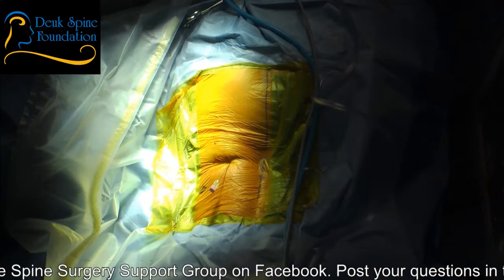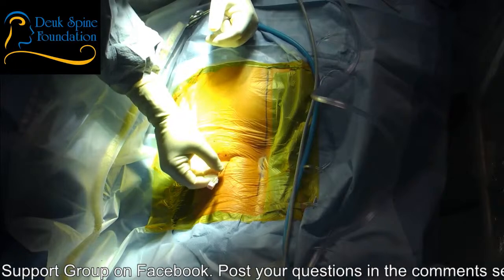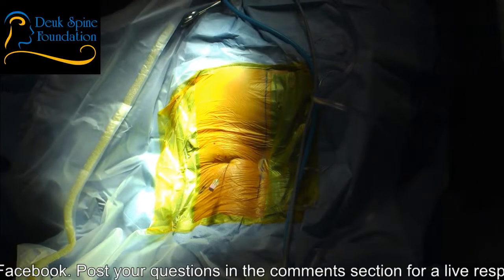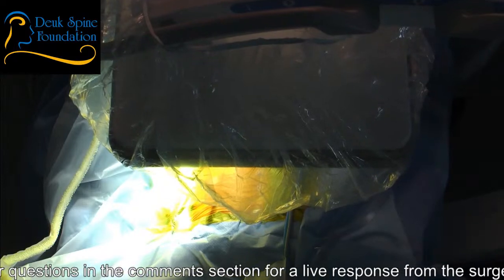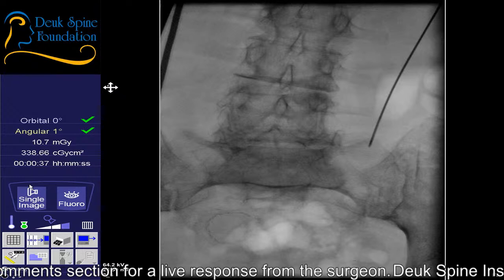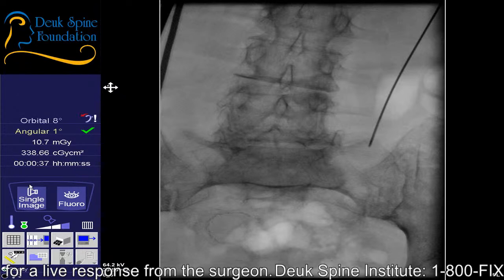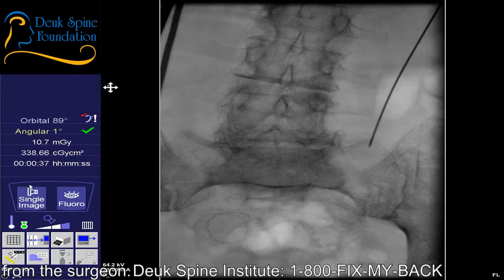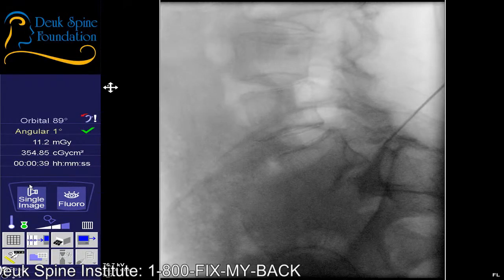Go ahead and give me an AP. So this is probably a 10.5 out of 10 — this is the hardest I've ever done. You can see we're starting really high up. We're too lateral — go back to a lateral, please. Two centimeters away, a little further than that.